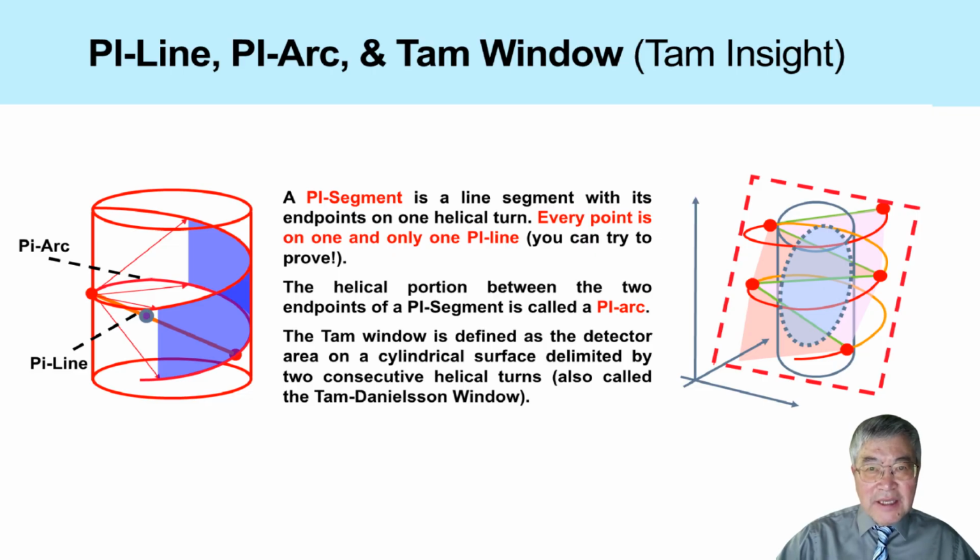That means exact spiral cone beam reconstruction of a small local object is feasible, at least from this weak perspective point of view. Based on this idea, we can heuristically understand and even rederive the Katsevich exact cone beam spiral reconstruction formula.